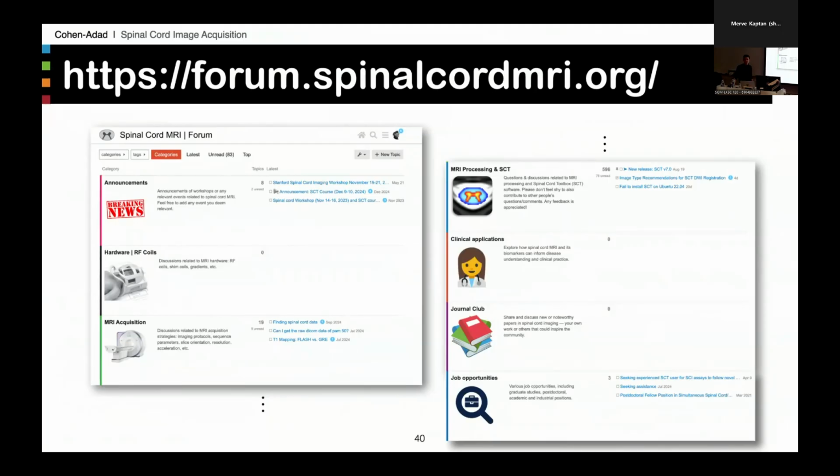I guess it's challenging when you have GitHub issues, right? And you post comments there. For Spinal Cord Toolbox, if there are issues about it, do you want them here or do you want them in issues? Yeah, so I want them here. This is the user-facing interface. GitHub is more for the core dev. Then when we see a user posting an issue here, we would open an issue on GitHub ourselves. That is more technical.